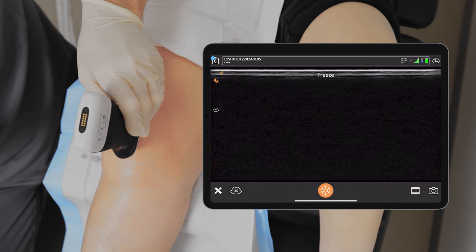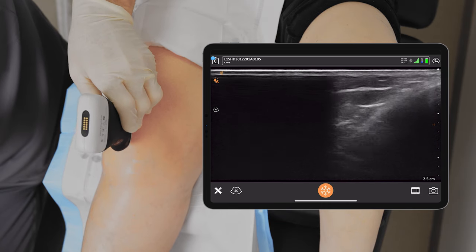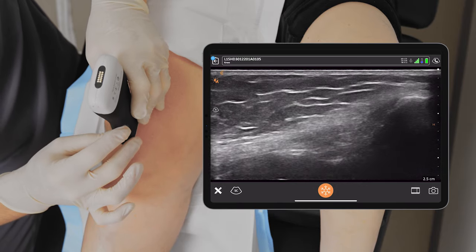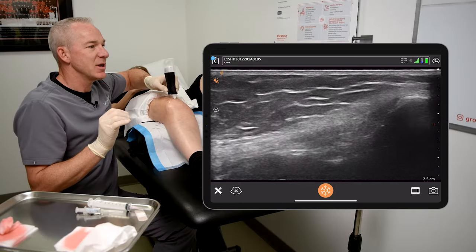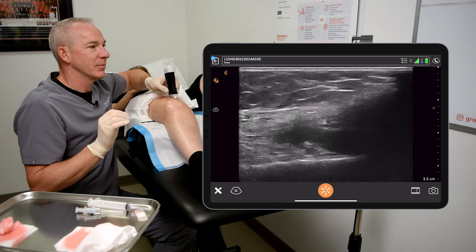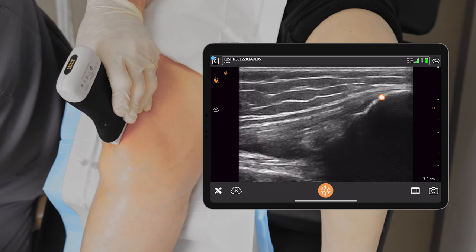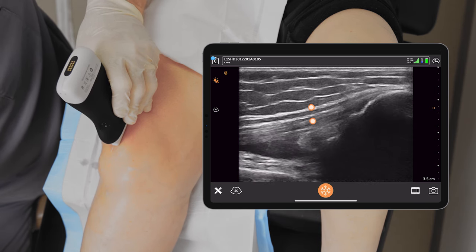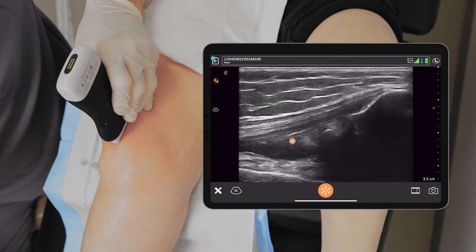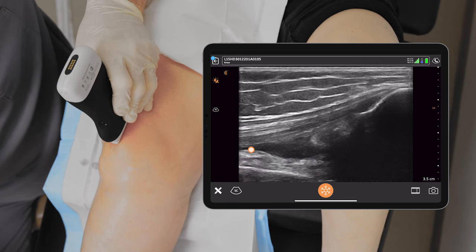Freeze. I'm going to place the ultrasound probe onto the proximal patella, then gently rock the probe onto the quadriceps. Increase depth. Increase gain. So what we see in the top right of the screen is the patella, the quadriceps tendon, the suprapatellar fat pad. We see at the bottom of the screen the femur and the pre-femoral fat pad.